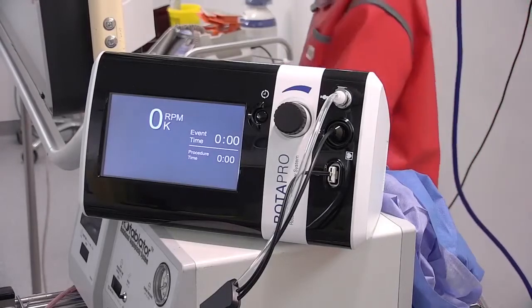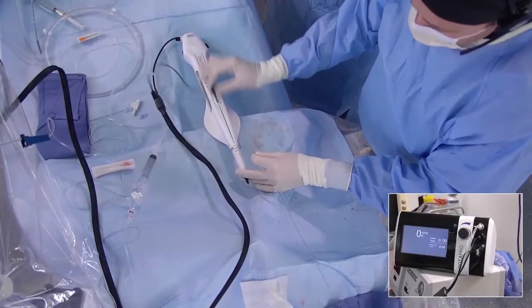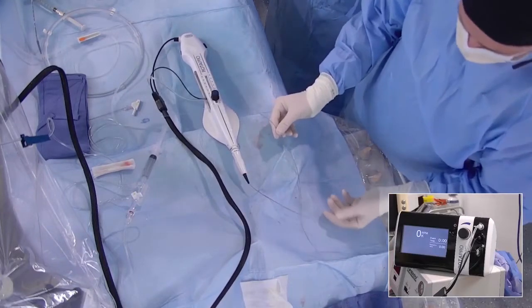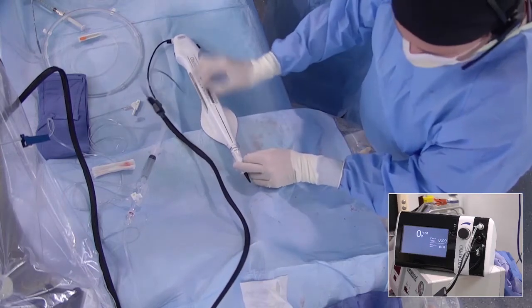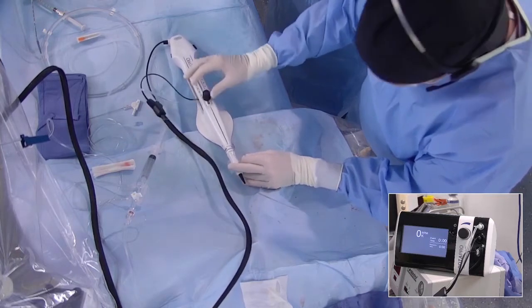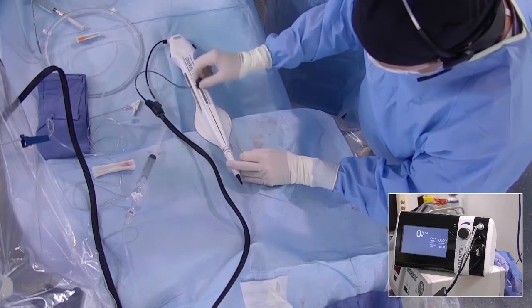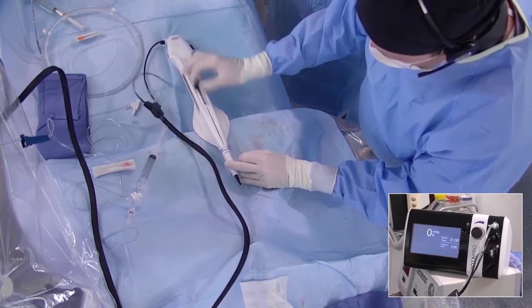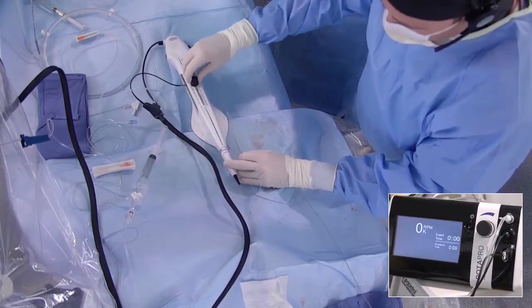So first, I will remove the bubbles of air, because sometimes it can induce distal embolization, and maybe you can see that there are a lot of small bubbles. So usually I do this to be sure. There are also bubbles, because I think it can induce slow flow, especially if there is a lot of air inside the device. I think it's okay now.